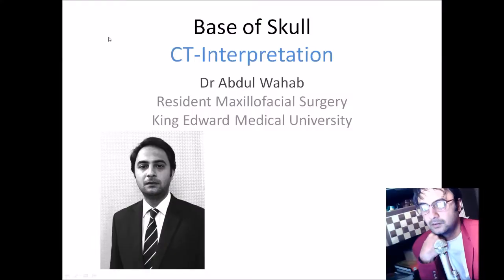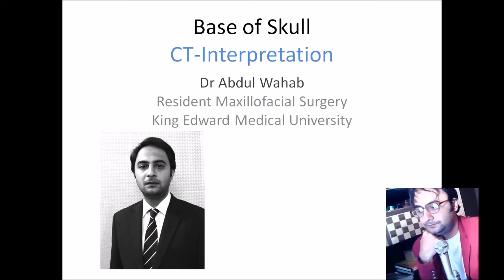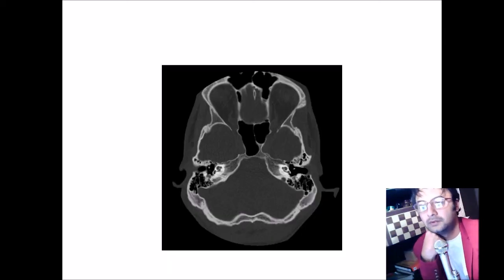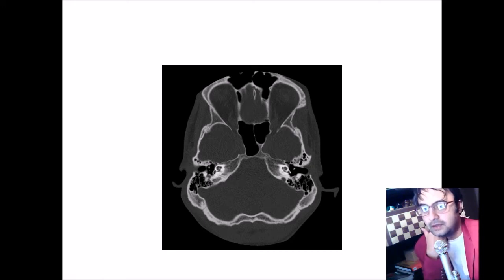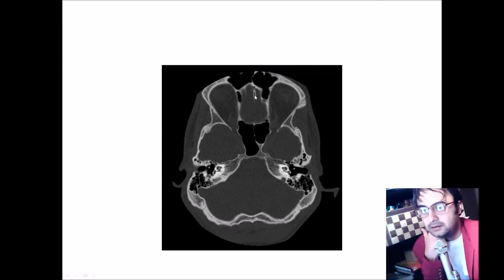Let's start with a quick review of the major landmarks present at the base of the skull. Here is an axial view of the base of skull on HRCT with a bone tissue window. Starting in the midline, in the inner anterior portion you see here is the crista galli, and these are the frontal sinuses.